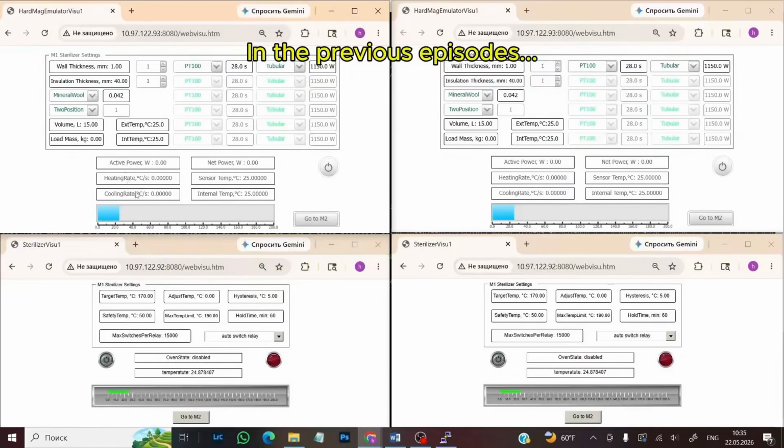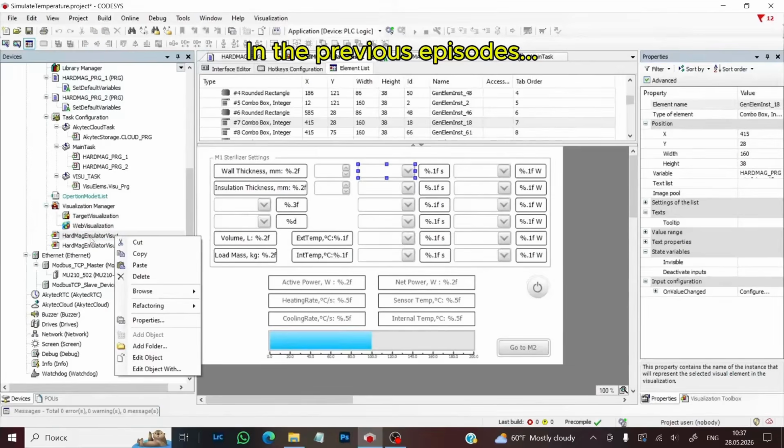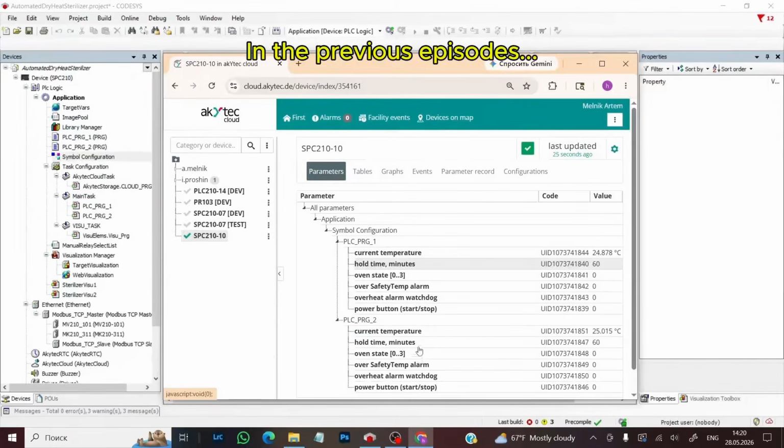Now, our prototypes support at least 2 sterilizer models with different characteristics, such as the insulation material, sterilizer chamber volume, number of heating elements, and number of internal temperature sensors. The next step was to rename our visualization using the refactoring tool. After that, we duplicated the visualization file. Now, Cloud supports 2 sterilizer models on a single SPC210.